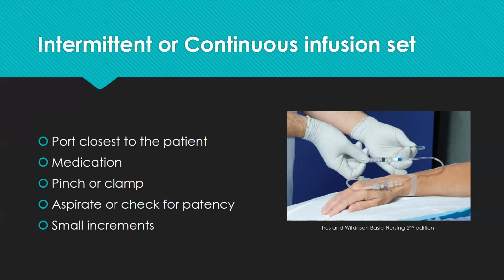And then you can choose to pinch or clamp intermittently while you're pushing that medication into the line, or you can just leave it pinched the whole time. So that's entirely up to you. Neither of them are wrong.